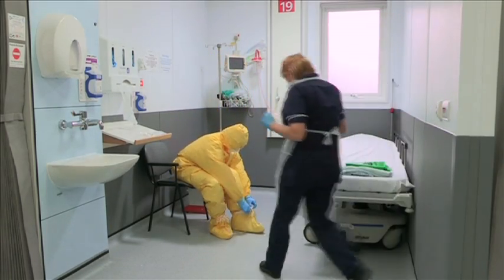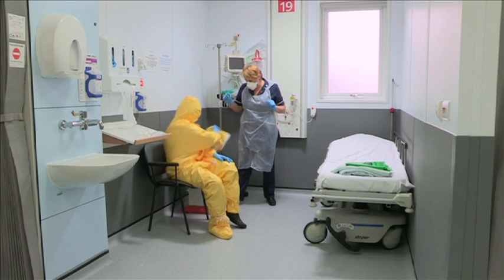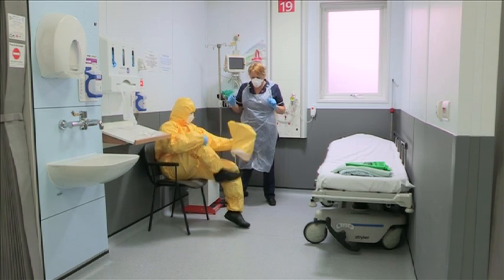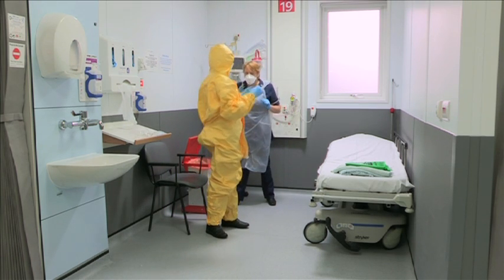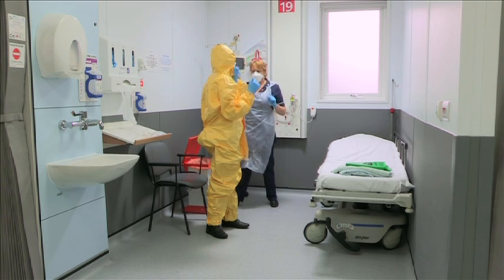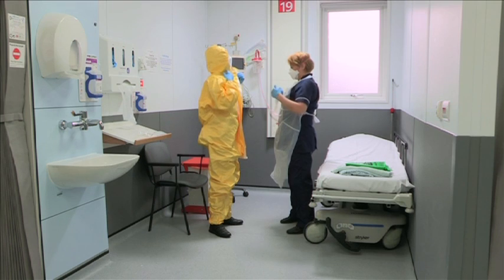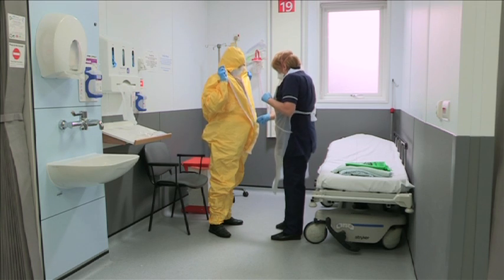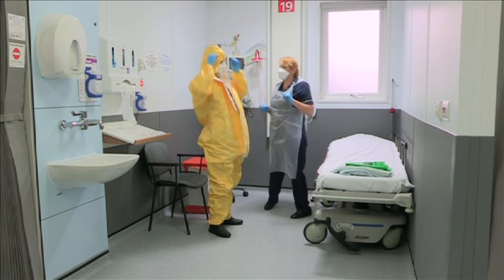Remove the overshoes with your gloves still on. The buddy can assist by holding open the bin or disposal bag. Remove the suit. The person wearing the suit should only have contact with the outside of the suit. The buddy can assist with the zip and contact with the inside of the suit to roll it inside out and dispose of it safely.